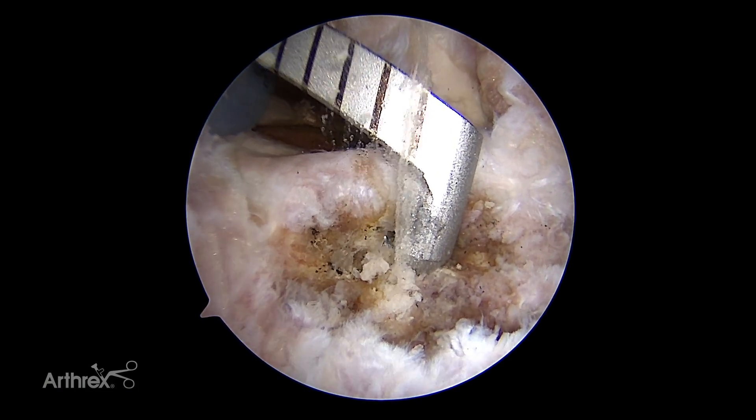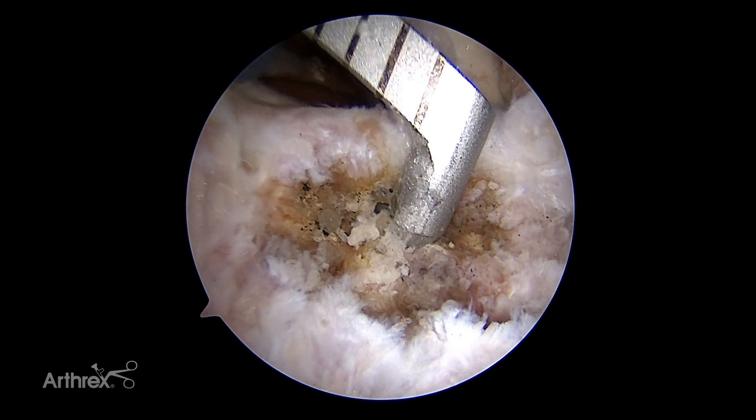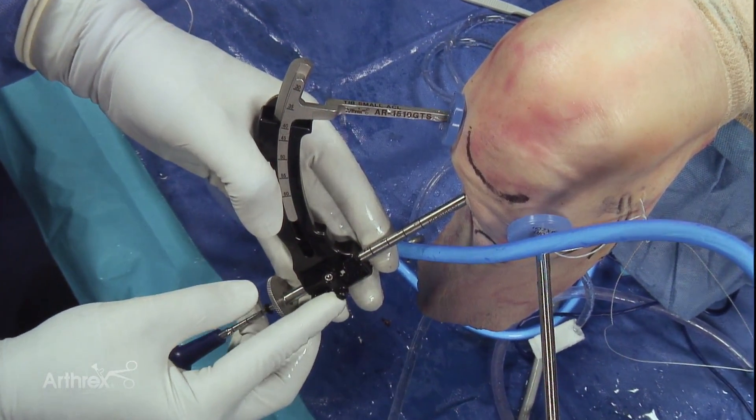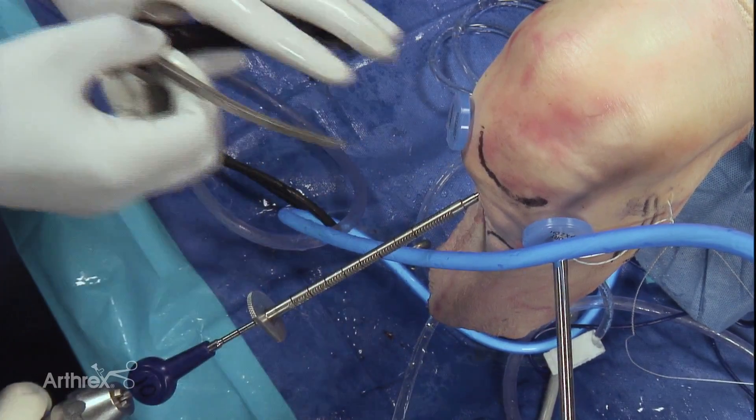You can see the flip cutter comes out just anterior to it. And if you'd like to demonstrate how we release this, I'm going to unlatch the locking mechanism — and it's as simple as that.